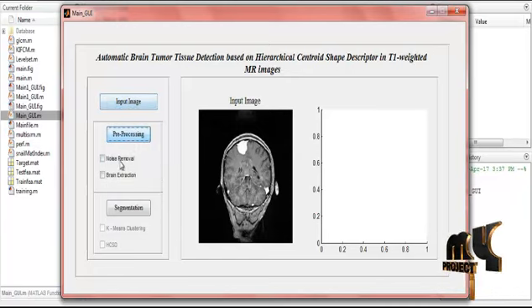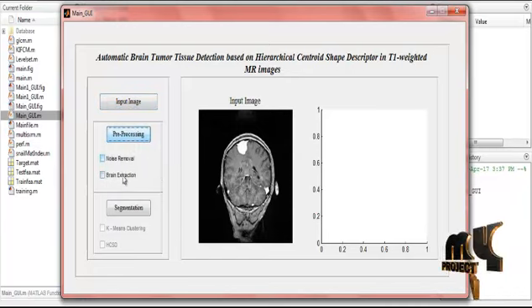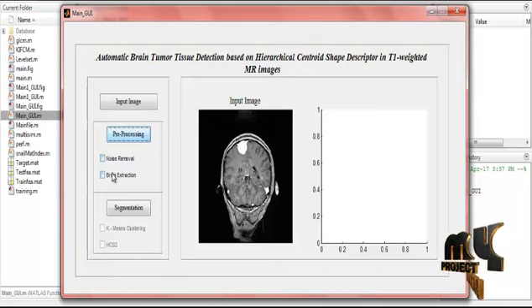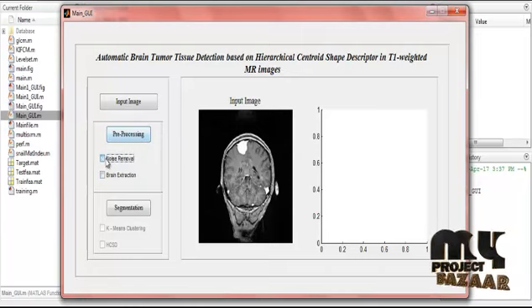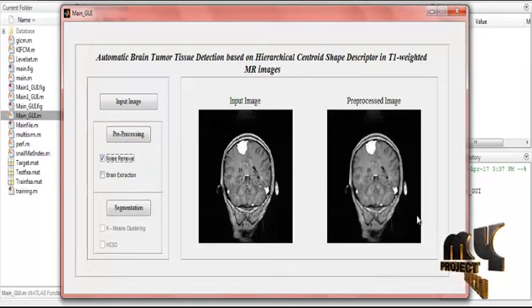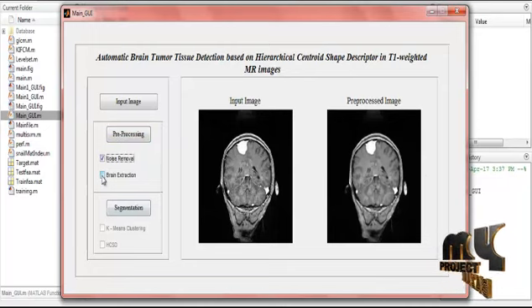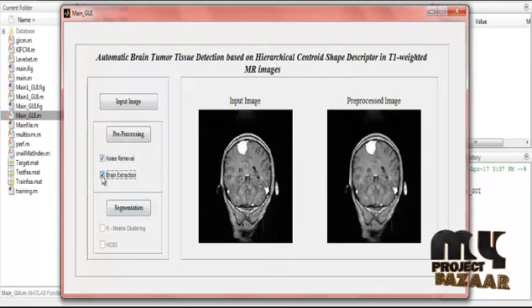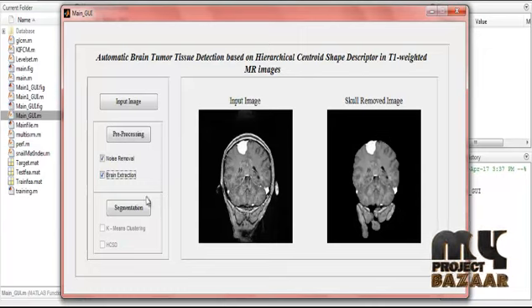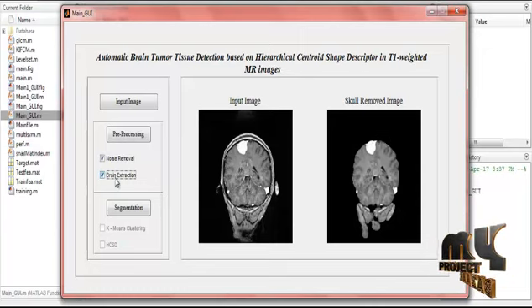In the pre-processing step, there are two types: noise removal and brain extraction. In the noise removal step, applying a median filter displays the pre-processed image. In the brain extraction step, the skull-removed region is displayed. This completes the noise removal and brain extraction of the process.